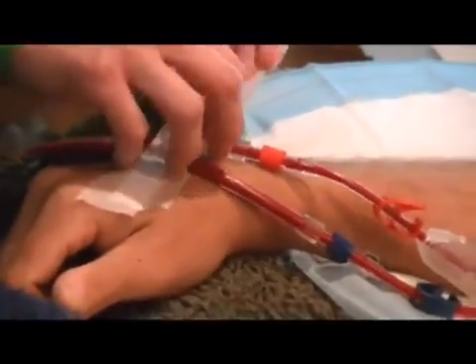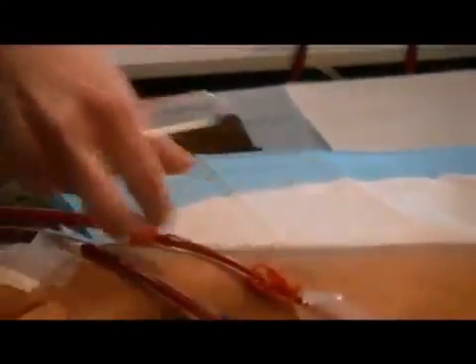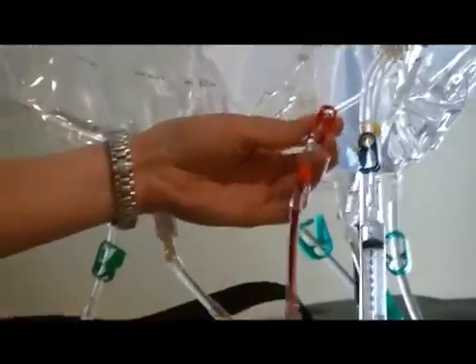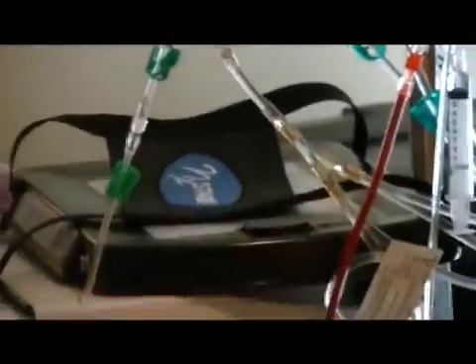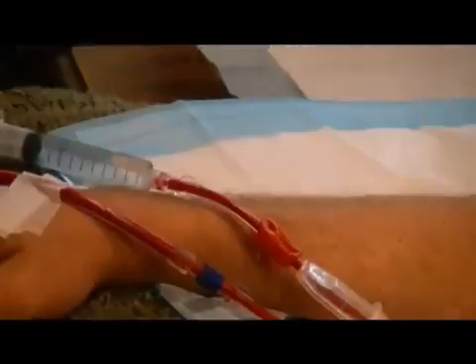Okay, at the end of treatment, we will unhook the red one, the arterial line, and put on the syringe with saline. You rehook the arterial line back up to the saline bag, open it all up, and you do what we call the rinse back. So it's taking all the blood that's in the lines and in the machine and putting it back into his body so he doesn't lose that amount. And whenever that finishes, then we hook the blue line back up and we'll flush his lines and tear the machine down.